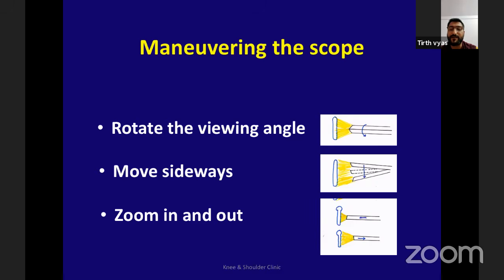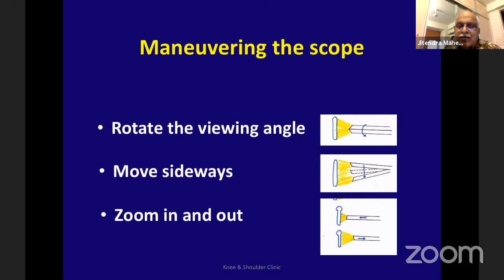What is your experience? As you know, the vertical incisions are more likely to cut these subcutaneous nerves, definitely, because they go in that direction. If you're making a horizontal portal, it is less likely to cut the nerve, but still you can cut. But what is important is the purpose of the portal. I have to make it vertical because that helps me to reach the midline, right?